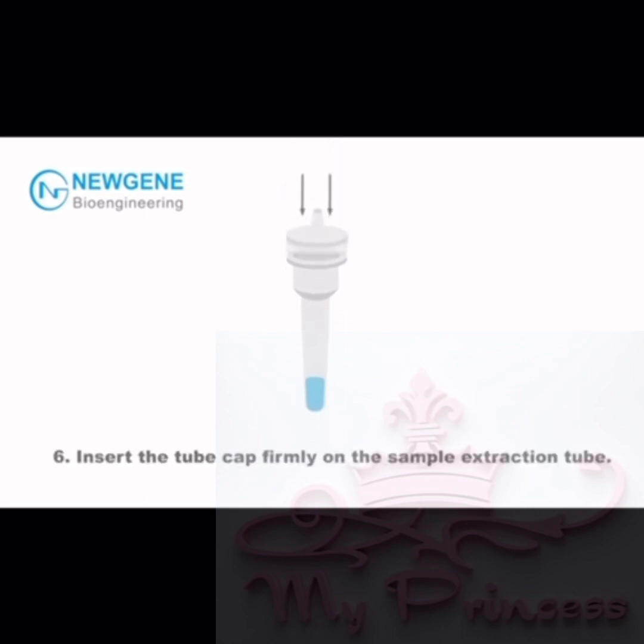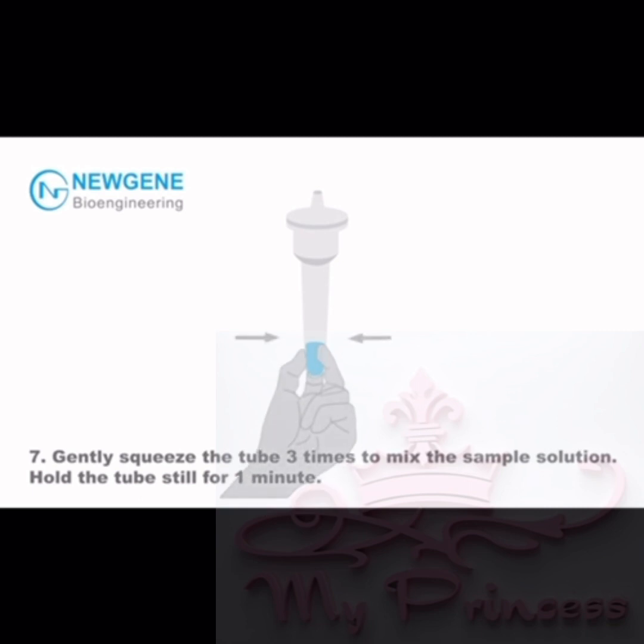Step 6: Insert the tube cap firmly on the sample extraction tube. Step 7: Gently squeeze the tube three times to mix the sample solution. Hold the tube still for one minute.